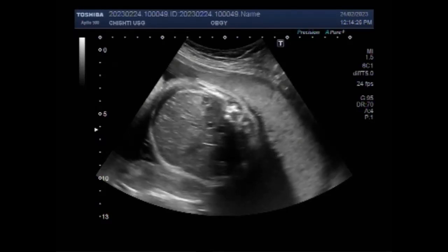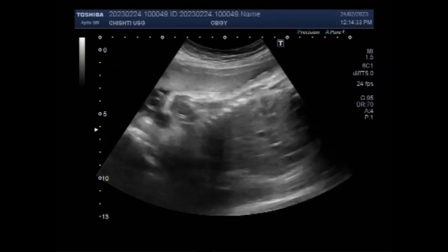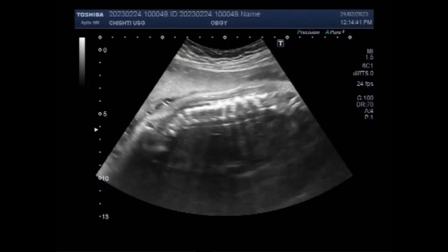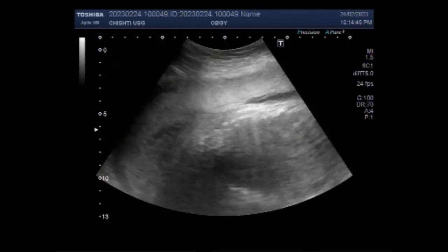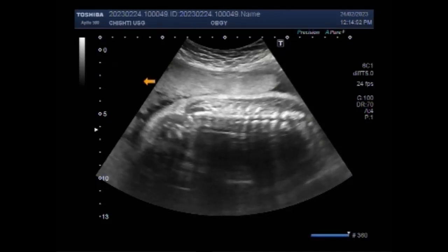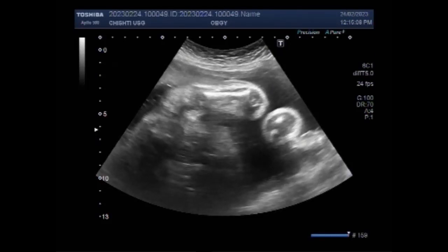Fetal limb deformity cases show a significantly higher rate than other congenital malformations for advanced maternal age, that is at or more than 35 years old. You can see the spine of the fetus and it is echogenically normal. Phocomelia is a rare condition that affects babies at birth, causing the upper or lower limbs to be underdeveloped or missing.